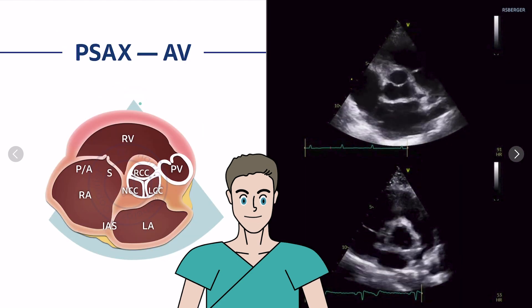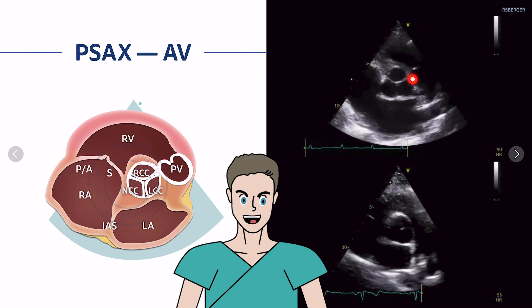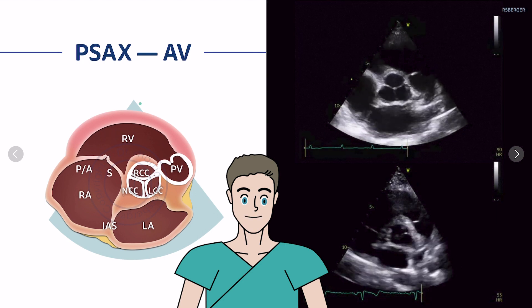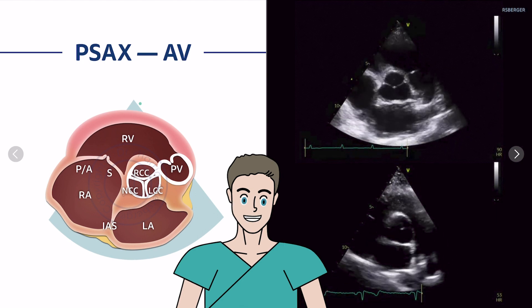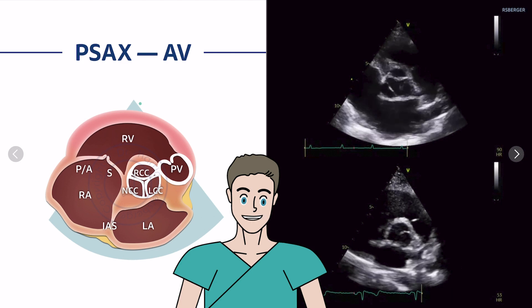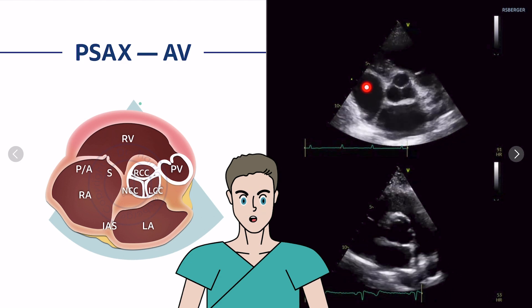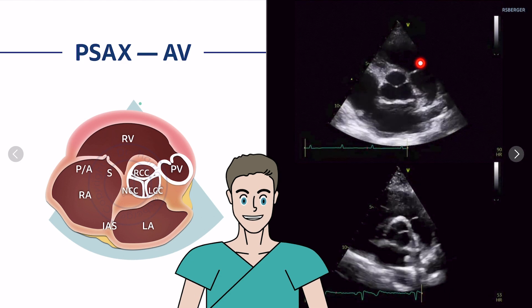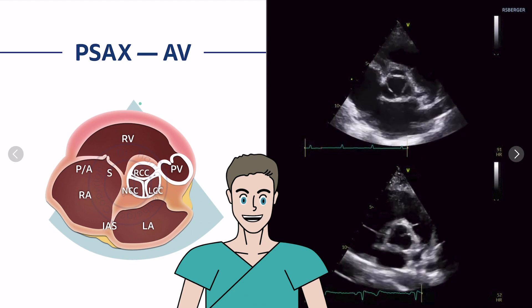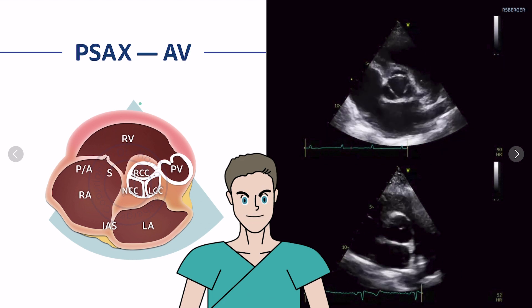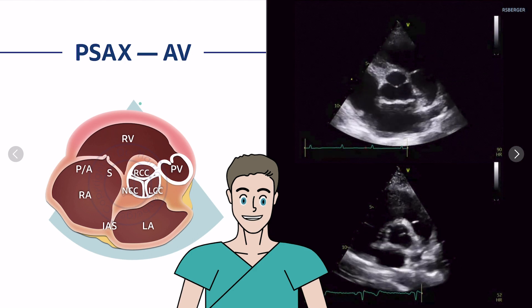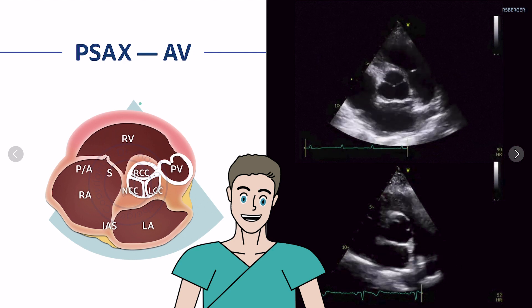In the B-mode image, you can see the aortic valve in the center. Not always is image quality perfect, but here you can differentiate the right coronary cusp, the left coronary cusp, and the non-coronary cusp, as well as the left atrium, right atrium, right ventricle, right ventricular outflow tract, pulmonic valve, and pulmonic trunk. Note that the left atrial appendage can also be visualized in this parasternal short axis view.